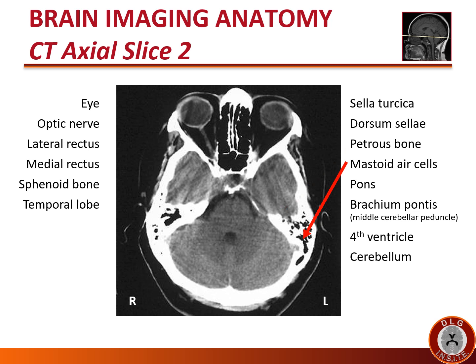Here we see the pons in the middle of the brainstem. The faint, slightly hyperdense round structure in front of it is the basilar artery, between the pons and the dorsum sellae or clivus. Brachium pontis literally means 'arm of the pons.' As you can see, it is an extension connecting the pons to the cerebellum, also known as the middle cerebellar peduncle.